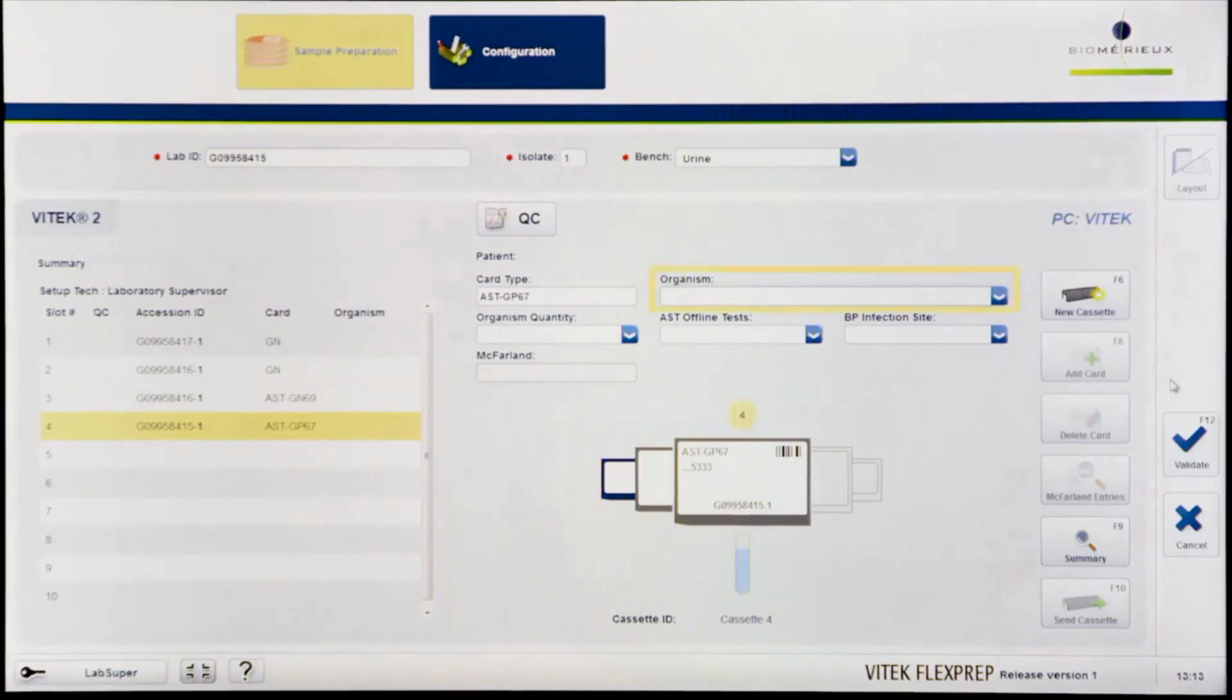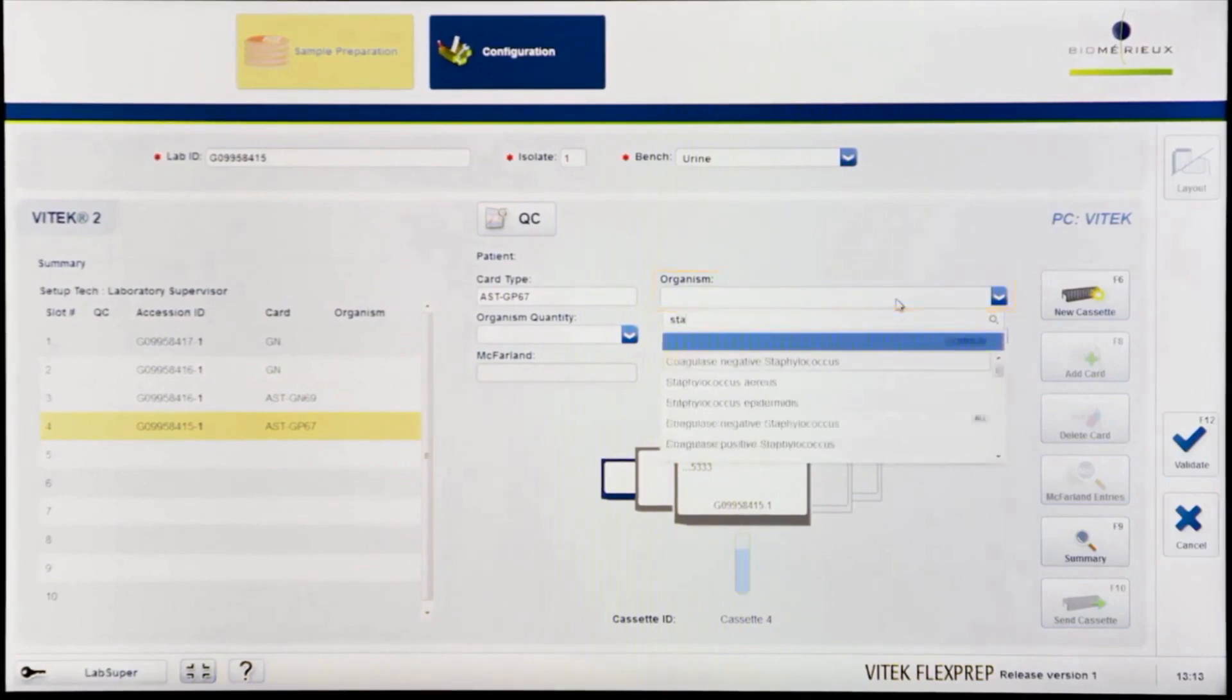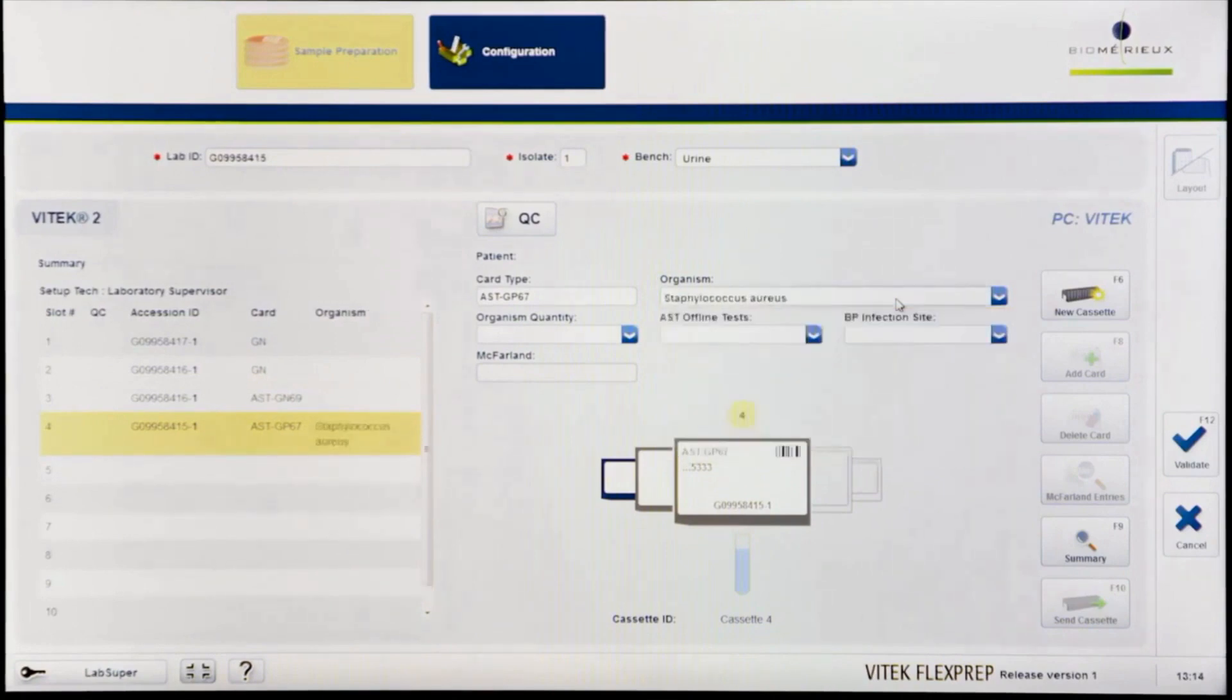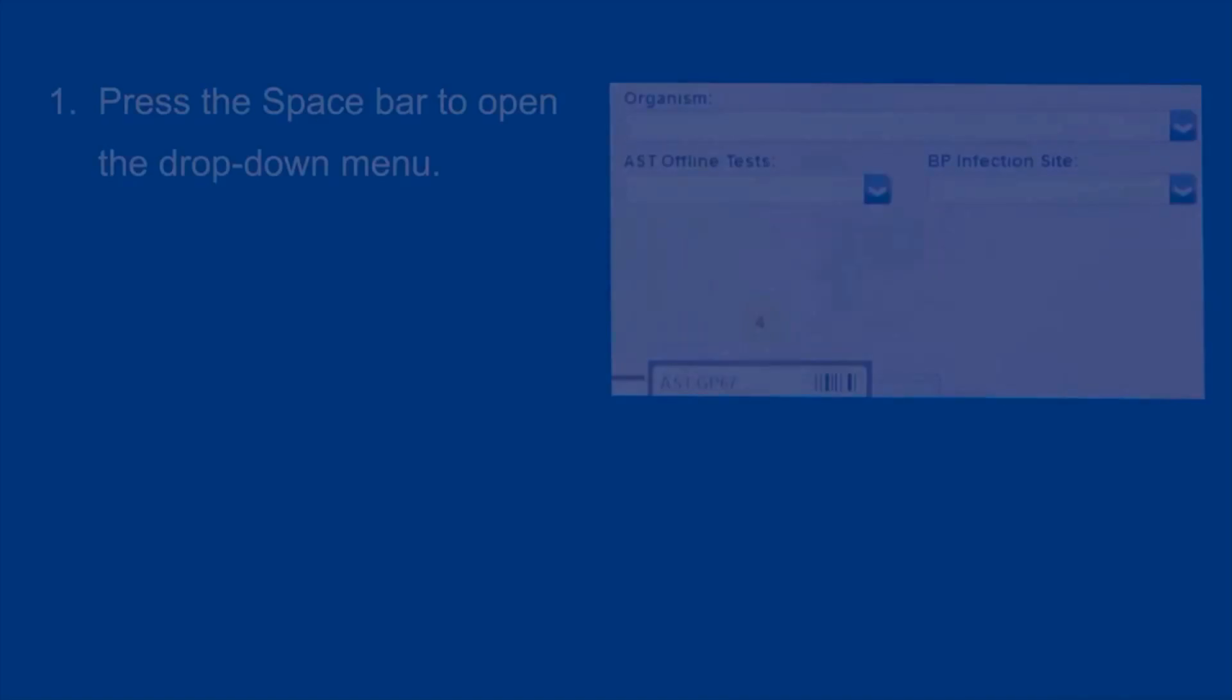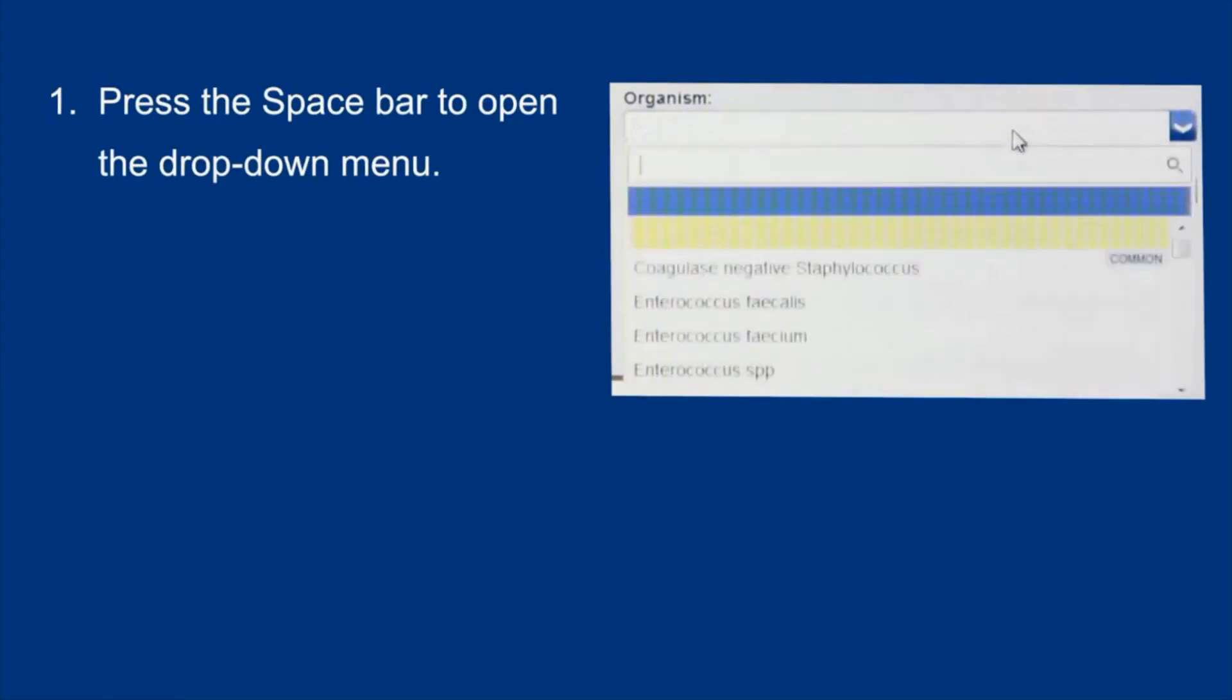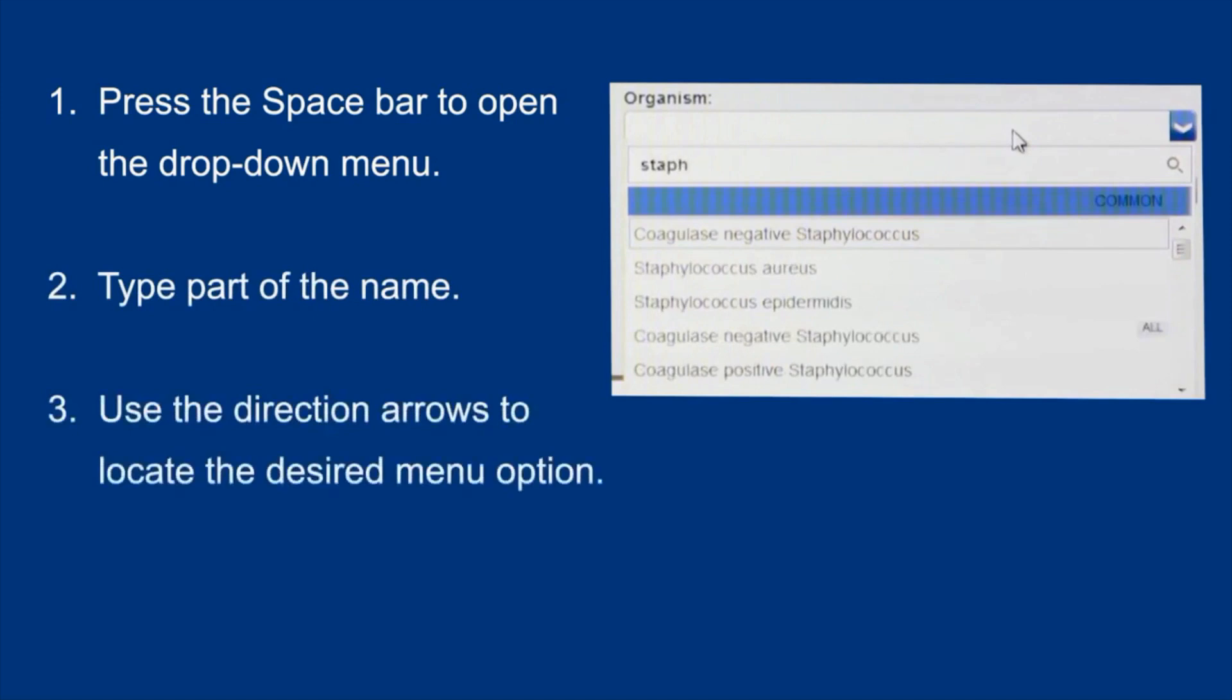Start typing any portion of an organism name and the drop-down menu will filter to the best matches available. Select the correct organism for the AST card from the Organism drop-down field. This may be accomplished most effectively through these steps: Press the space bar to open the drop-down menu. Pressing the space bar activates data entry the same way pressing the left mouse button does. Type part of the name. Use direction arrows to locate the desired menu option. Press Enter to select it.